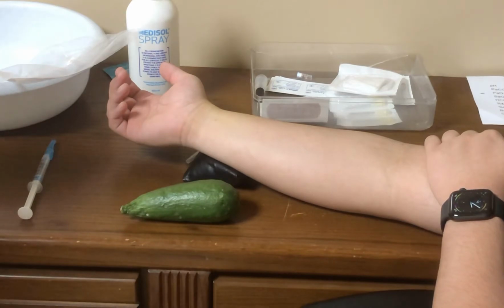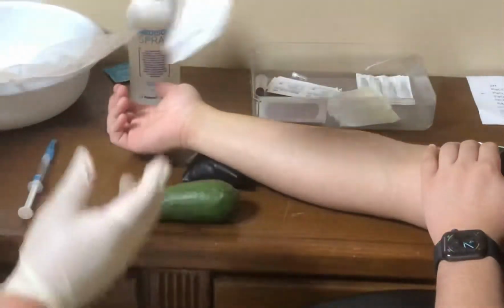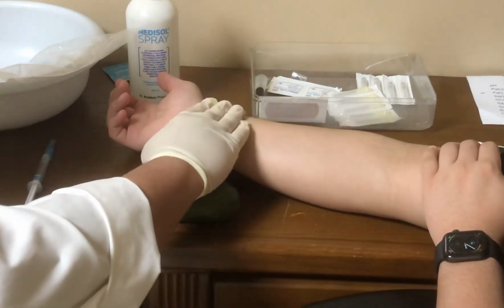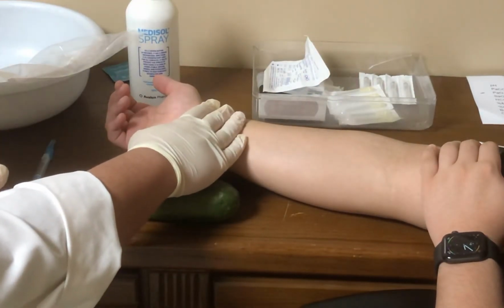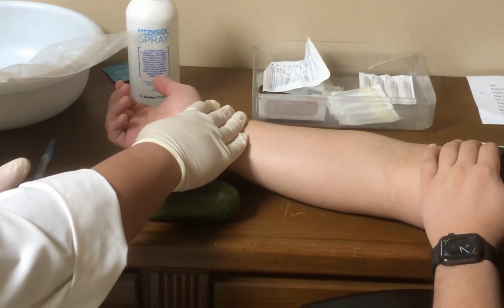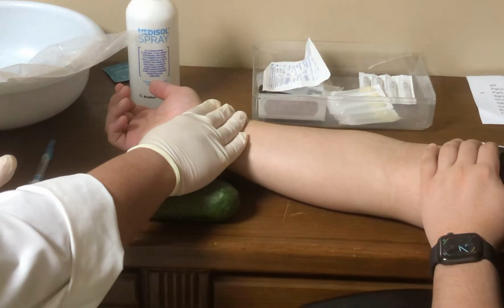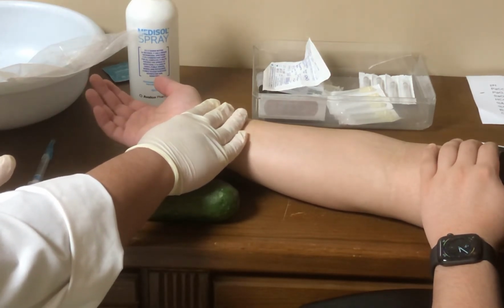After this, we need to take care of the patient by taking the sterilized gauze and applying pressure to it. You apply pressure to the site for 5 minutes or until the bleeding stops. If the bleeding persists, put an ice pack just in case, and it will cause the bleeding to stop. Hematomas following arterial puncture can cause circulatory impedance, discomfort, and predispose to infection.